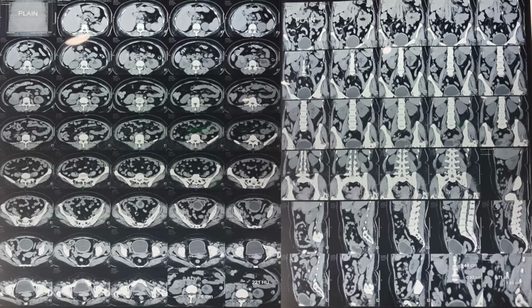Okay, sir. So the next question comes. What things will you be expecting from the next CT scan, which should be, as Pankaj sir said, a triphasic contrast enhanced CT scan. And in this patient there is a renal mass, so definitely it should also include the thorax. So it should be a triphasic contrast enhanced CT scan of thorax and abdomen-pelvis. Now tell me what you want to see in the CT scan of any patient having a renal mass.